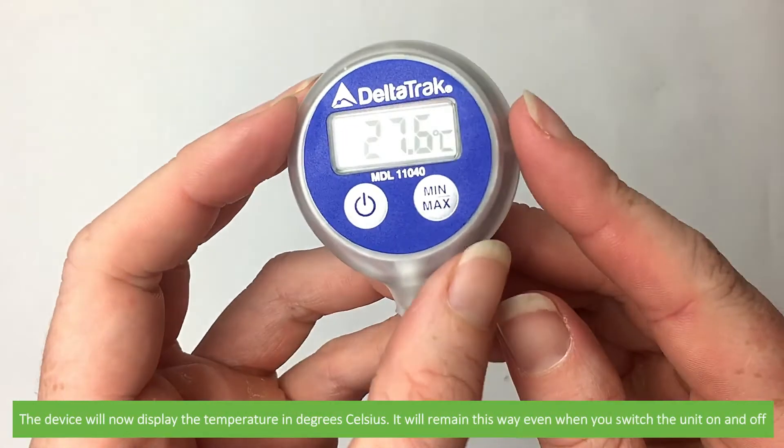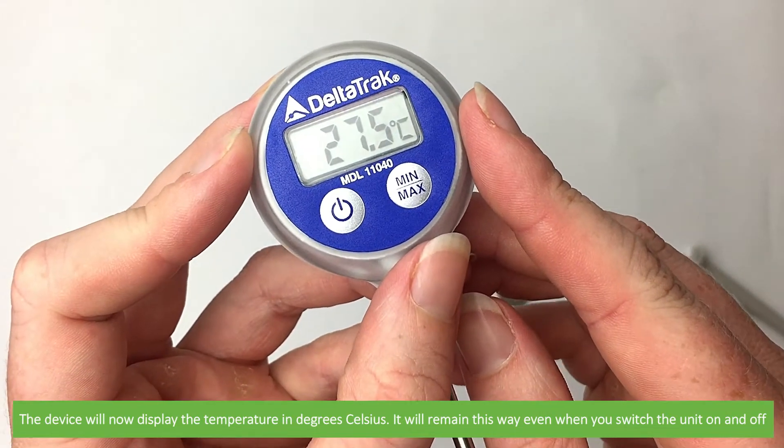The device will now display the temperature in degrees Celsius. It will remain this way even when you switch the unit on and off.